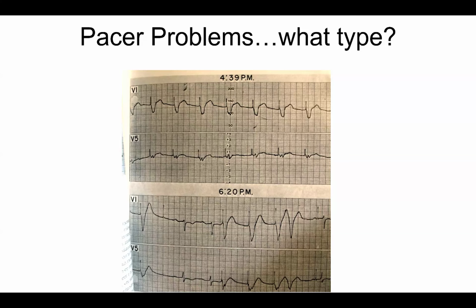But the bottom line is, what surgeons are asking is whether you can make the pacemaker asynchronous so that they can use as much Bovie as they want without worrying that the heart rate is going to be affected. Generally, that's a safe approach, but the concern is that in the absence of sensing, when you're making it asynchronous, this type of thing that we're seeing here in this panel at 620 could happen. If the patient has a very low underlying rate, let's say the patient's in complete heart block with a rate of 27, and you put the magnet on and you're pacing at 60, the likelihood of a problem is low.